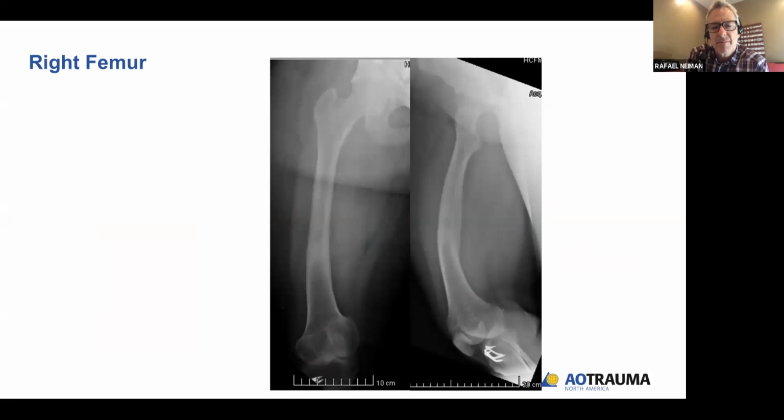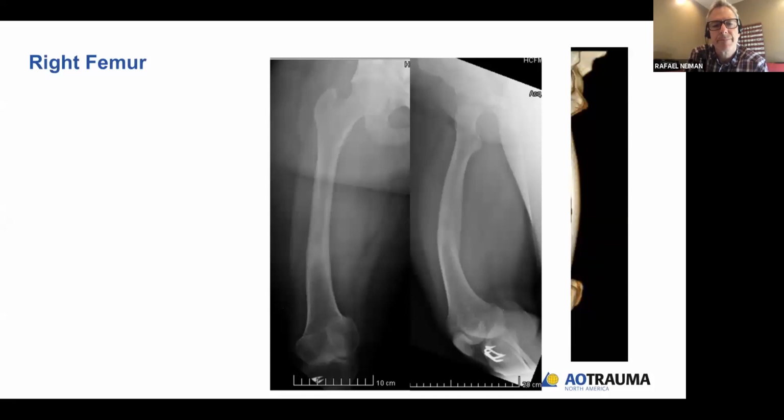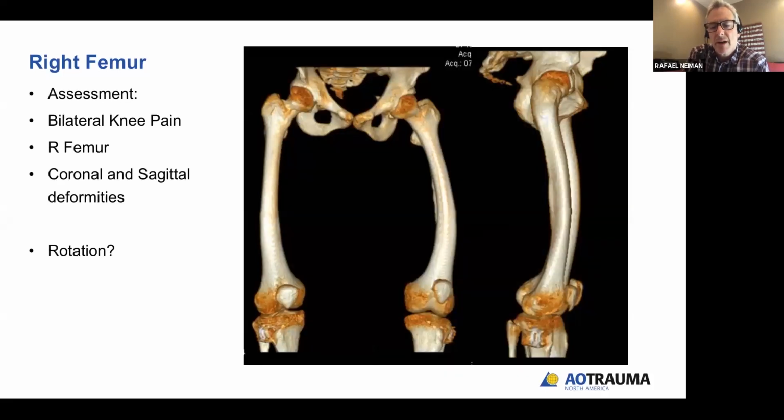So you see a femur with a coronal plane deformity, which is moderate, and then quite a bit more deformity in the sagittal plane. I can't tell you why he got the CT scan that he did. We've had discussion over the last week about when it's indicated to get CTs for these extra-articular deformities. But he has it. I suspect that the reason is for the torsional deformities, because you really need to understand that when you're going for complete correction.